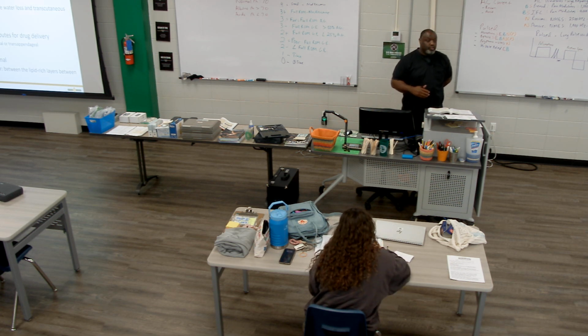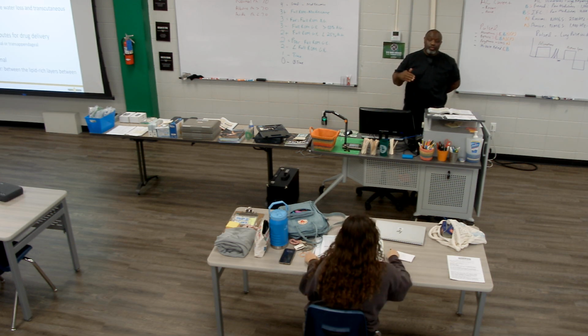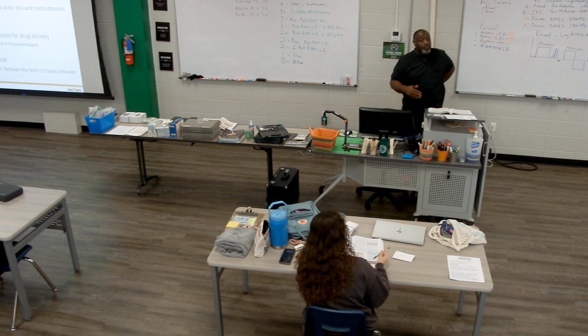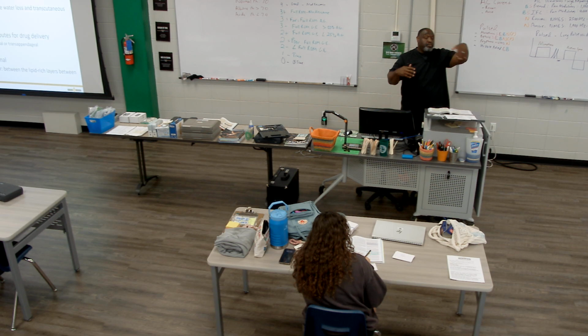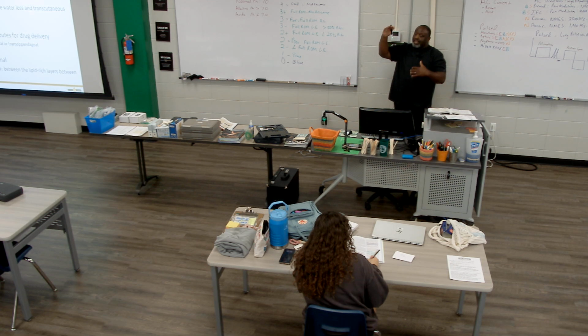We're going to use drugs that have a charge built into them, and we're going to use an electrode with the same charge, and we're going to use the concept that like things repel, and we're going to turn on current underneath that electrode, and it's going to repel or push the medication from the electrode into the body. It's repelling it into the body.